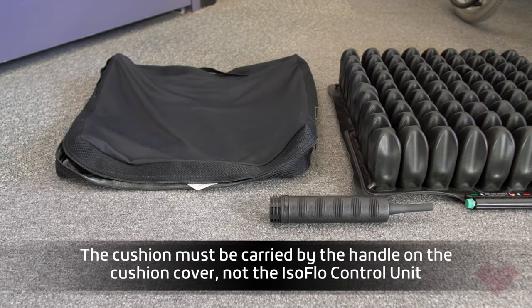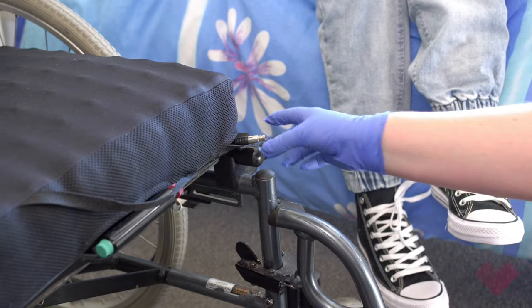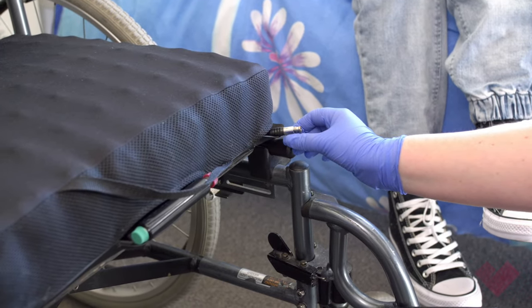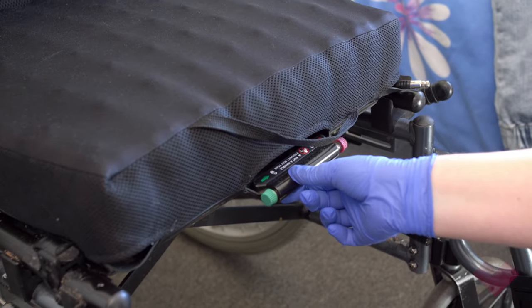You will require the cushion, the Roho-specific cushion cover, and the pump as seen here. The front of the cushion will have the air valve to your right-hand side of the wheelchair, with the isoflow memory control unit being between the person's legs for easy adjustment.